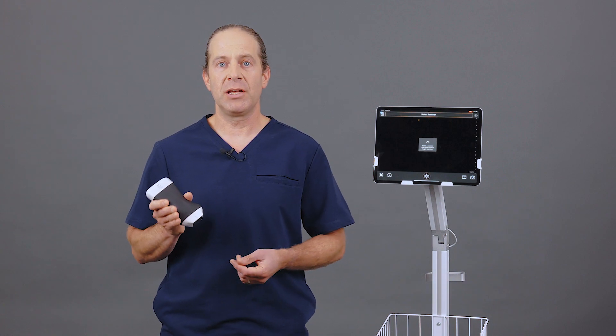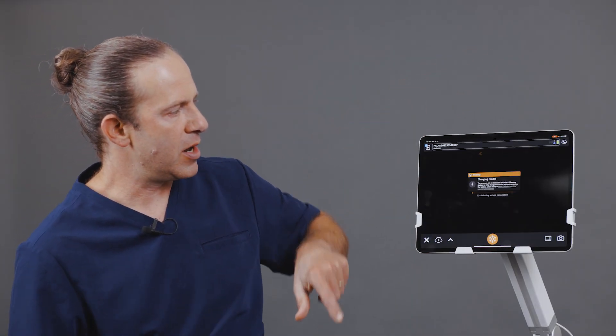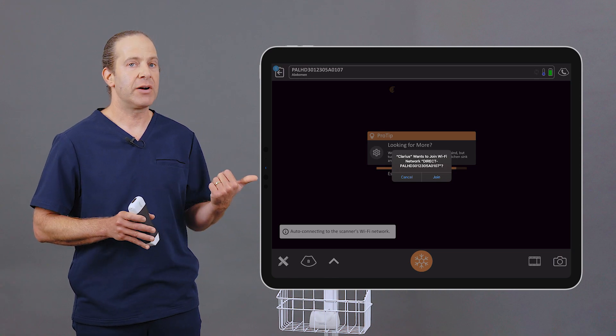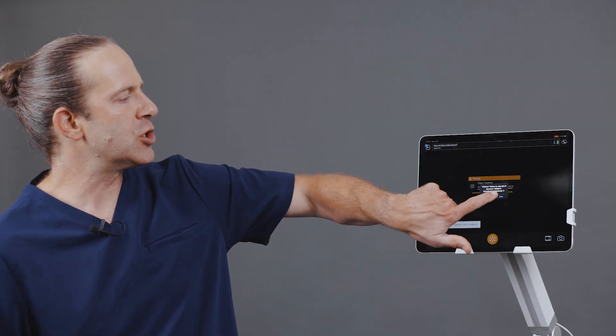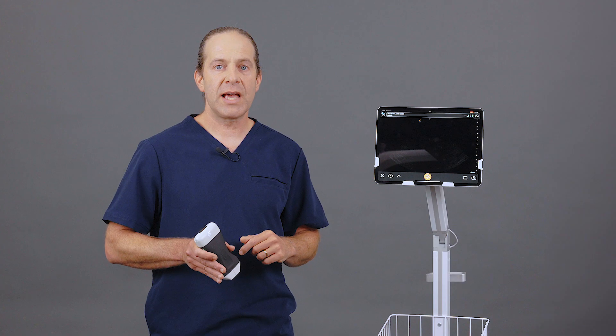The first step in using the scanner is to sync it with the app. You'll go to Select Scanner and power it up. This creates a direct Wi-Fi connection between the scanner and the Clarius app. Make sure to click Join and that will complete the connection.